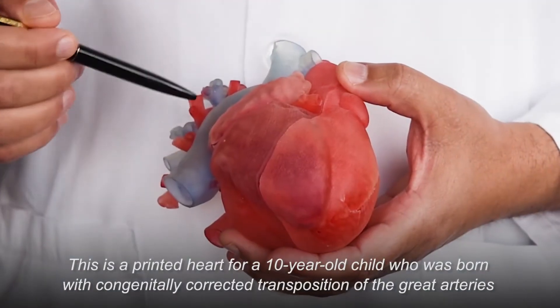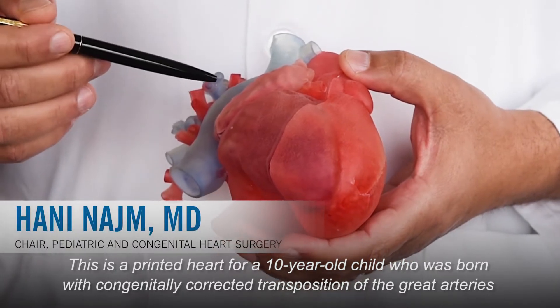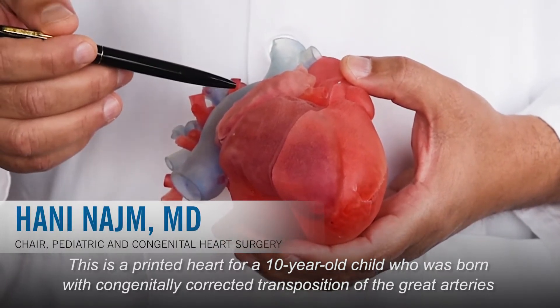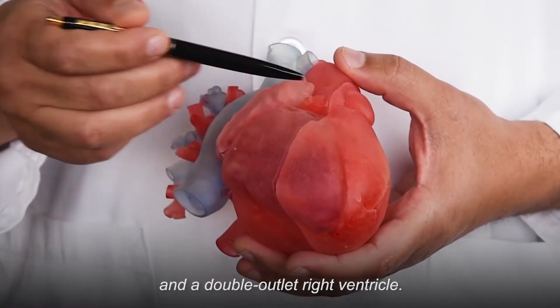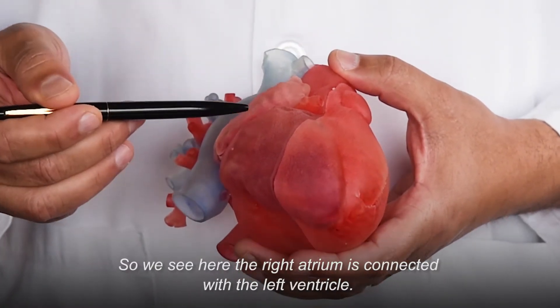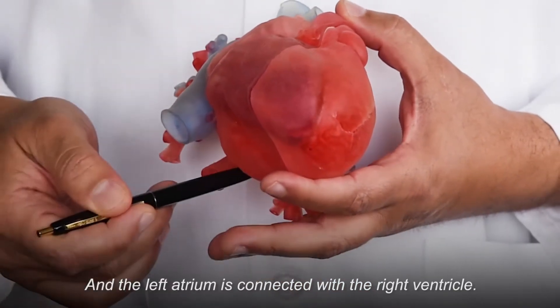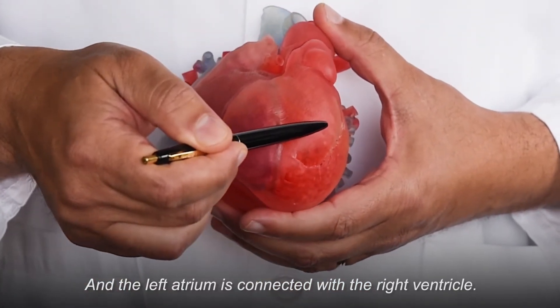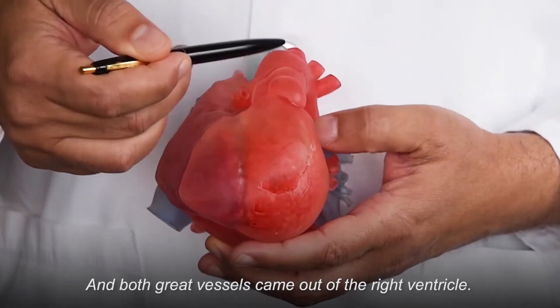This is a printed heart for a 10-year-old child who was born with congenitally corrected transposition of great arteries and a double outlet right ventricle. We see here the right atrium is connected with the left ventricle, and the left atrium is connected with the right ventricle, and both great vessels come out of the right ventricle.